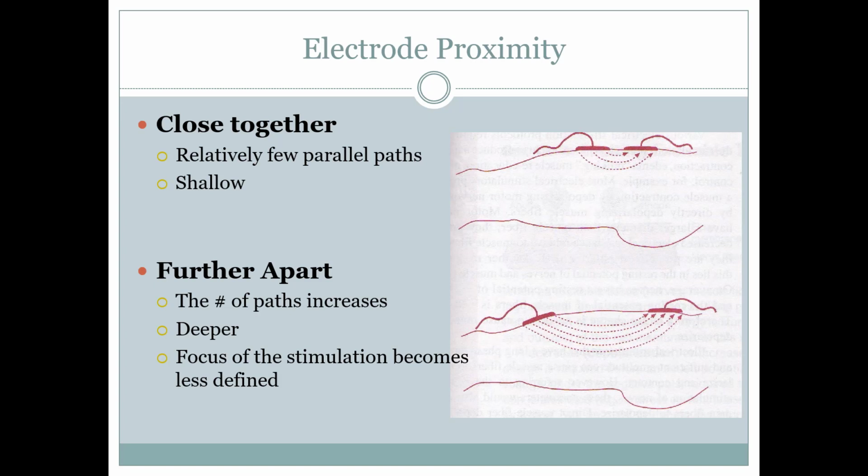For some clinicians, spreading the electrodes further apart causes concern, especially when electrodes crisscross the spine. Some clinicians will refuse to crisscross the spine with electricity for fear of stimulating the spinal nerves with a deeper treatment area. Of course, this is just a theory. In all reality, electricity is going to travel along the path of least resistance. While this picture has a demonstration of a fairly deep penetration of electrical energy within the quadriceps muscle, this is not actually the way the body works.